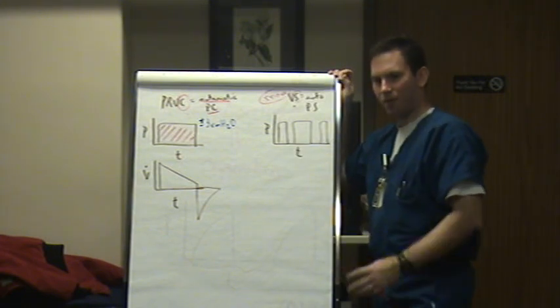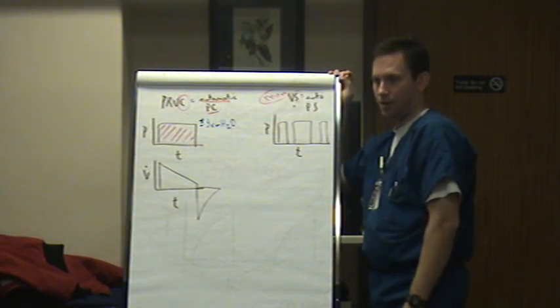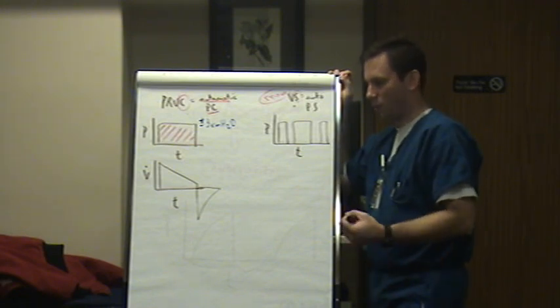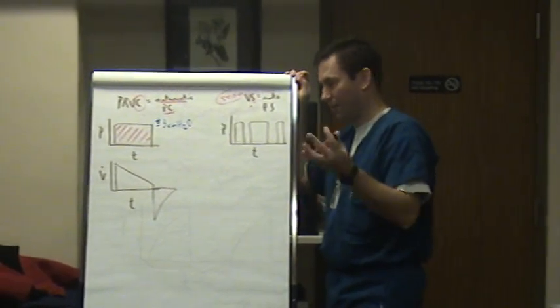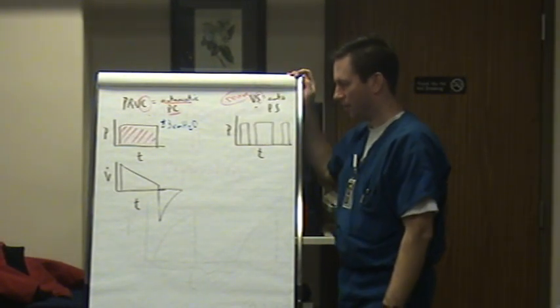Yes, if I'm on volume support, I can breathe like this. Or I can stop for 5-10 seconds. I can breathe again. It's not waiting on me to take a breath and just shove something in me when I don't want it. It's just going to wait, it's letting me do all the work, except it's going to help me with that tidal volume. It's basically going to supplement me with that tidal volume.